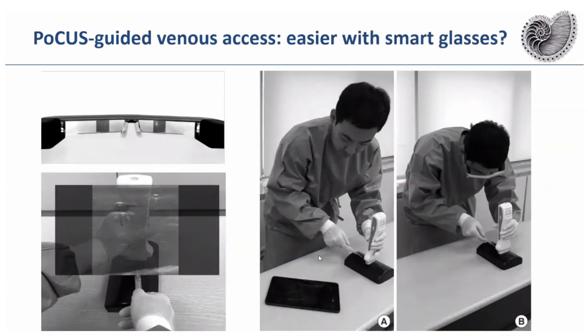But I think this is not a simple bedside intervention at home of the patient, but it was shown only for comparison. And this may be interesting for some of you, who are friends of new techniques. And I know that Paul Sidhu has asked some vendors of ultrasound machines why they don't sell such a technique up to now, because it makes working with needles easier. You do not have to turn your head to the screen of an iPhone or another smartphone or a tablet. Using such smart glasses, virtual reality glasses, you can look at your target, at the arm of the patient, for example, and then advance the needle, and you will see it in your virtual reality glasses parallel to the situation at the surface of the patient.